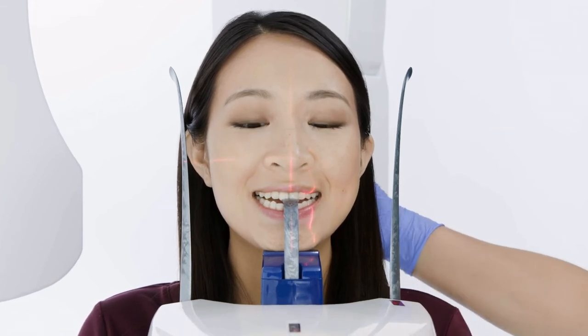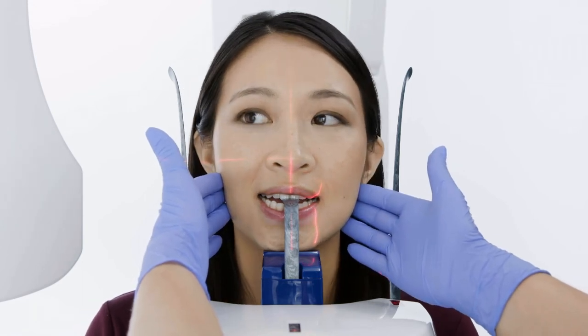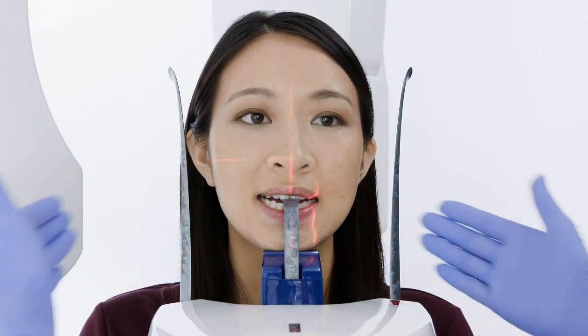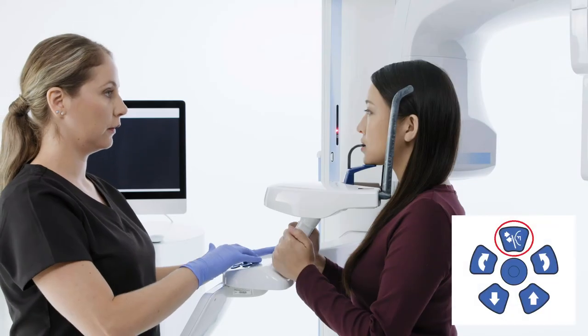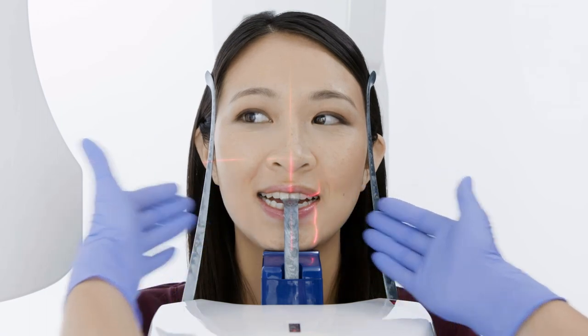Have the patient smile wide and raise or lower the unit until the posterior occlusal table is at a slight downward angle. Close temple supports. Align the mid-sagittal laser between the eyes by moving the head left or right.